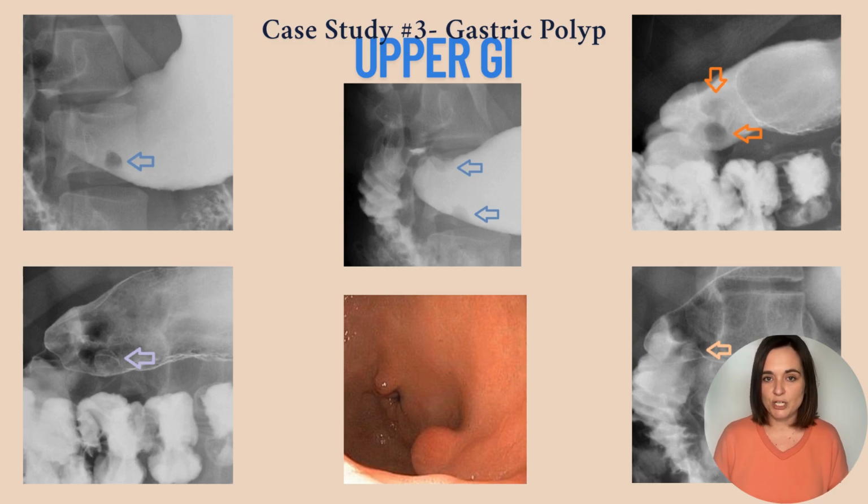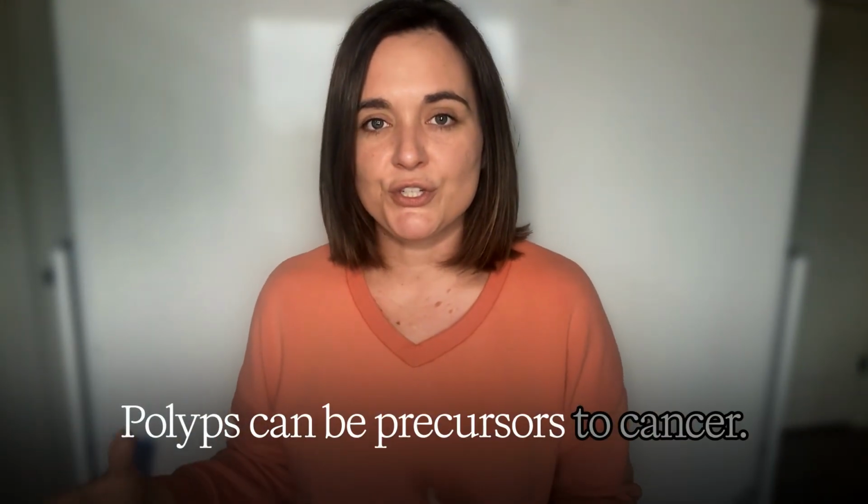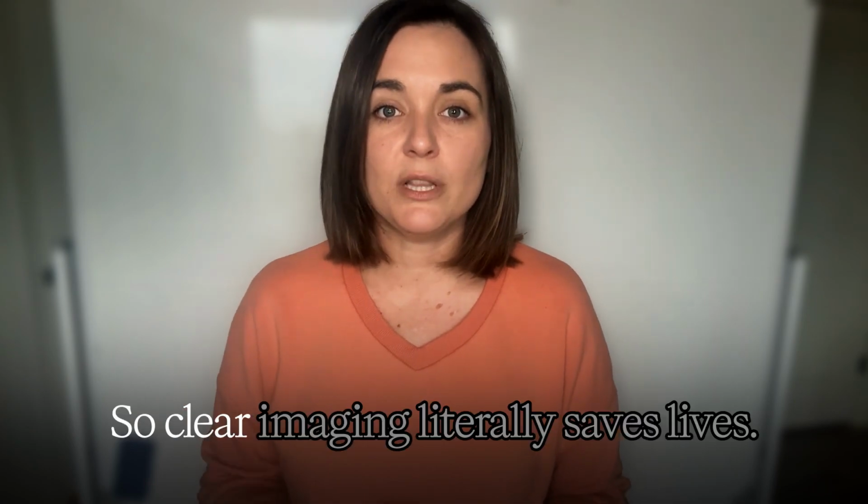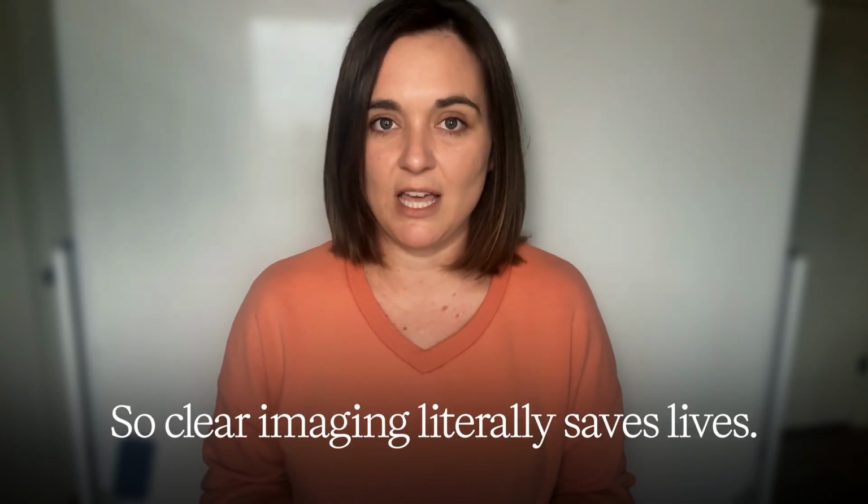RAO and LPO projections help outline the lesion by contrasting air and barium on different surfaces of the stomach. Polyps can be precursors to cancer. Radiologists flag them for endoscopy follow-up, so clear imaging literally saves lives.